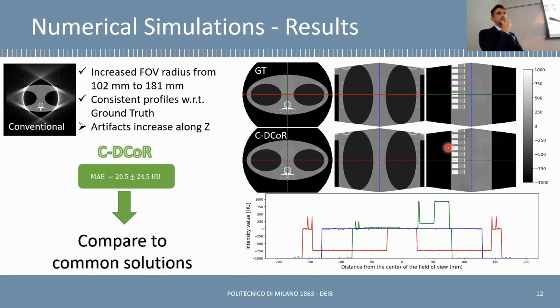No, so, well, if I have an object that is inside the FOV and can be acquired with a normal full fan geometry strategy, would it be bad to just use a short scan, just to understand your point of view? Yeah, in 3 dimensions it would be bad as well. But would it be bad to acquire, let's say, a head of a patient with a 220-degree full fan scan? You would rather use iteratives to reconstruct them.